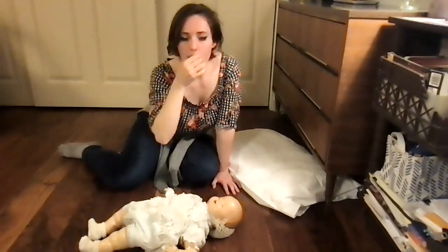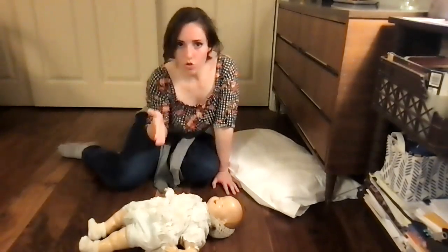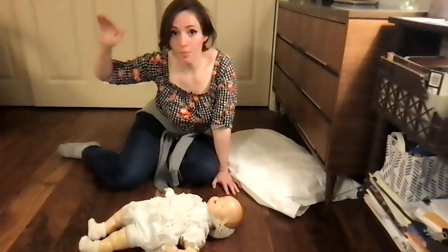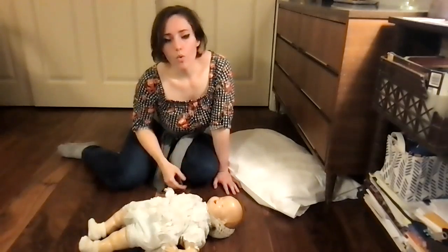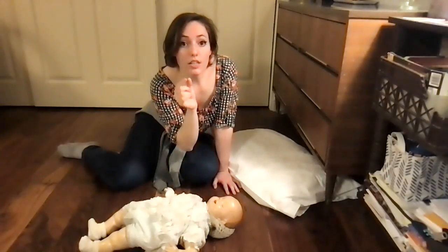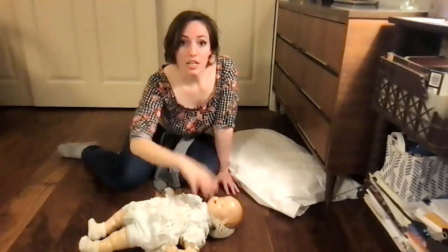The way it works is, if you look at the curve of oxygen getting delivered, it goes up, up, up as you're giving compressions, and then as soon as you stop compressions, it drops. Then you have to rework with compressions to get it back up, and then it drops. So the shorter your breaks in between your CPR, the more successful your CPR will be.